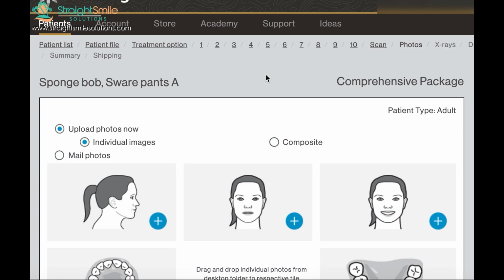So it's going to get expensive. A lot of doctors end up picking Express or Lite, and they end up paying way more than they would have for Comprehensive, and they regret it. They're like, oh, I wish I knew about that. No, submit them all as Comprehensive.